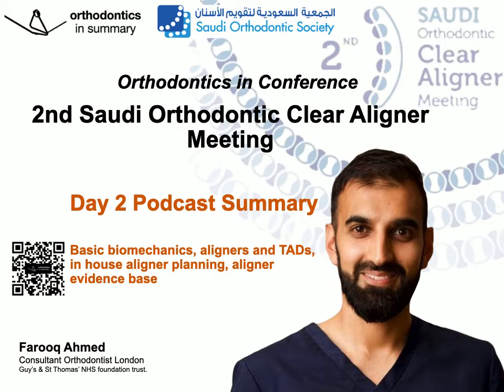Renato then went on to describe intrusion movements, and he described the same principle, again, of staging the movements. So if we need to intrude canines and lower incisors, for example, intruding the canines first, and then intruding the lateral incisors subsequently. He described rotations and how they are challenging movements. He always recommends overcorrecting rotations by 30 to 50%. The greater the rotation, the greater the overcorrection that's required.